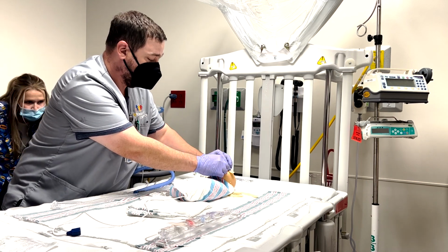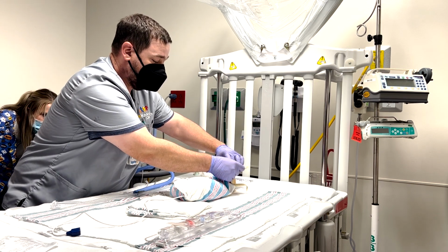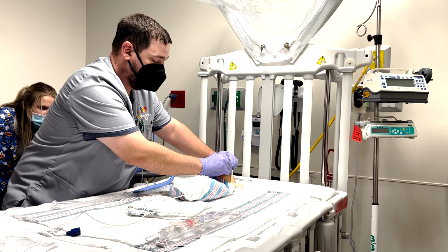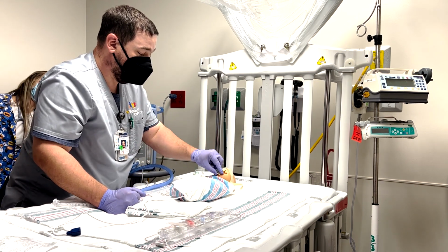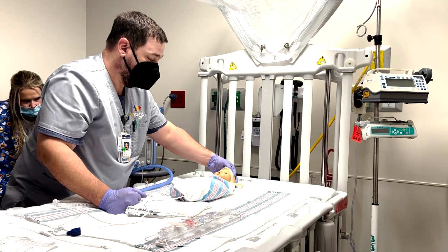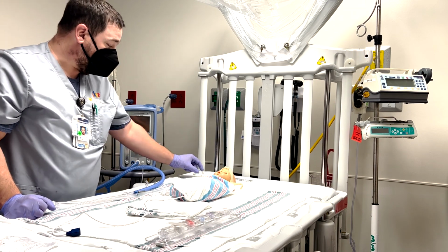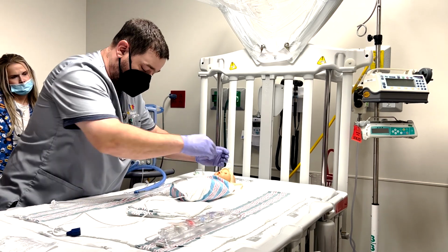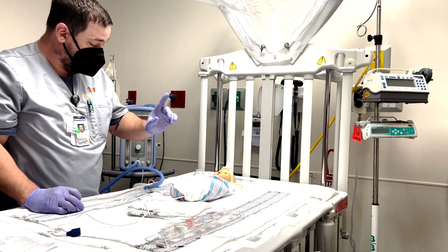Okay. This has the number 2 on it. It comes down like so. This has a number 3 right here. Tighten that all up. Pull it across like that. Now what do I do with this? Back like that. Now why this piece is important is because you put it across here, and this is eventually what's going to hold your manifold here. I'll show you in a minute.